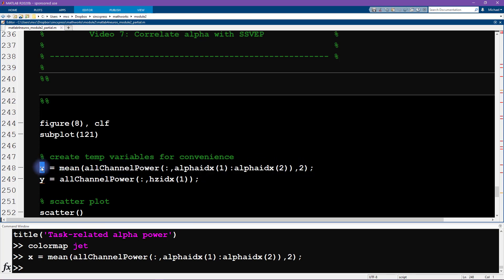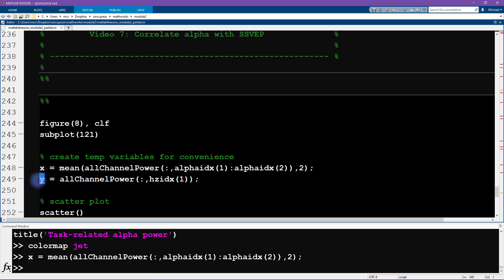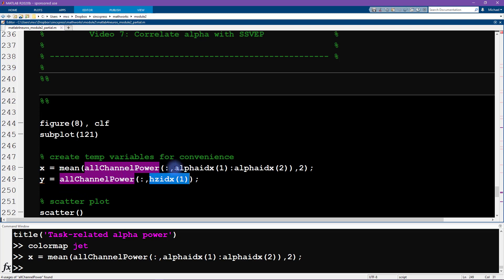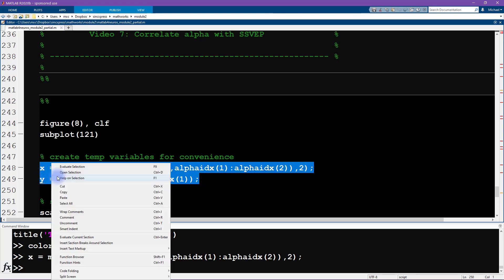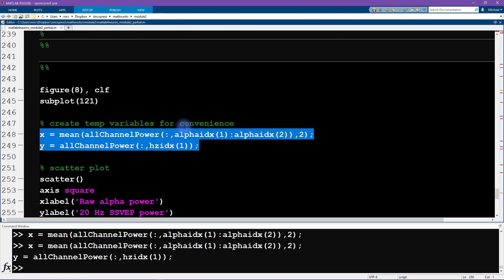Now for the rest of the code in this video I can just work with this variable x instead of having to use all of this inside the plotting code and the correlation code. The y-axis variable is also coming from all channel power, it's exactly the same variable, we're just selecting a different frequency. Here we have a range of frequencies from 8 to 12 hertz, and here we just have one frequency at 20 hertz.